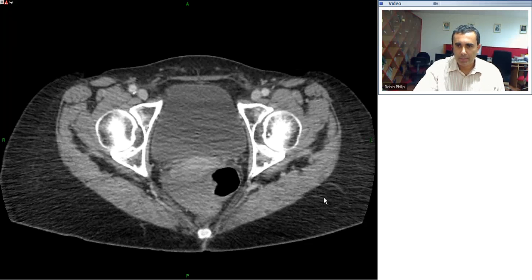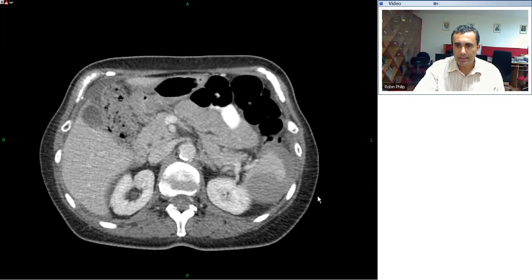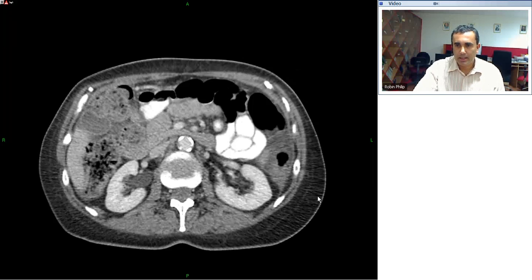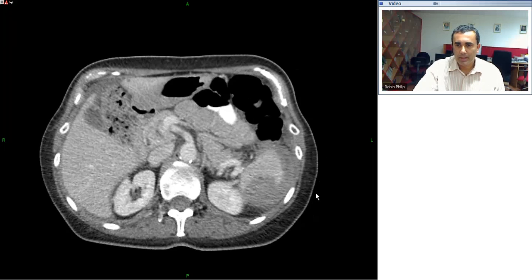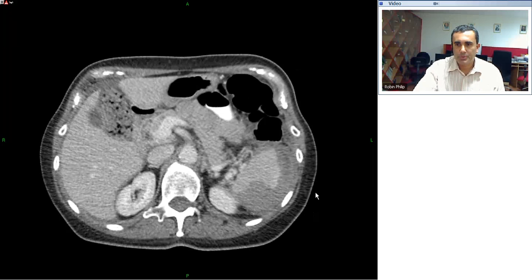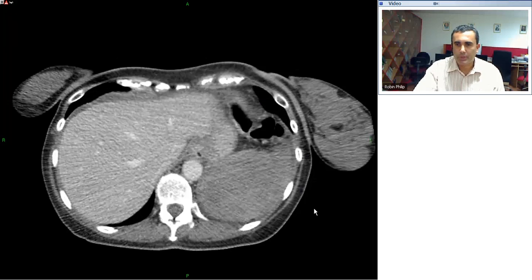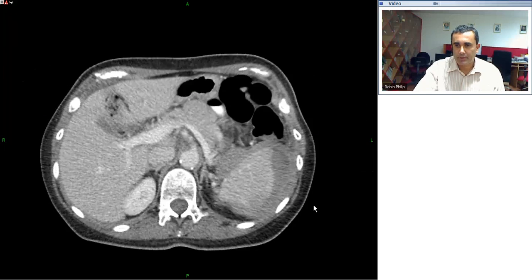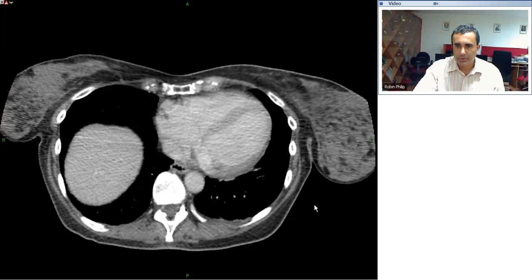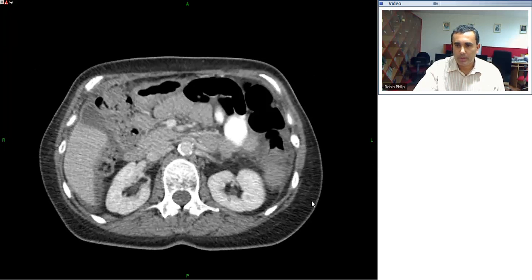This is a complication of colonoscopy that is described in the literature. It is believed to be a result of the fact that the splenocolic ligament forms a point of continuity between the spleen and the colon, and predisposes the spleen to injury at the time of the scope negotiating the splenic flexure of the colon. Something to look out for in a patient who presents following colonoscopy with left upper quadrant pain.